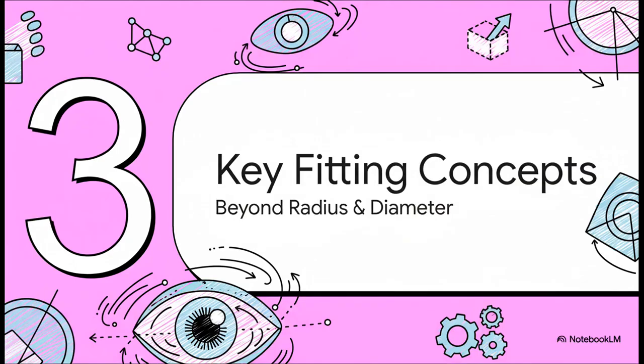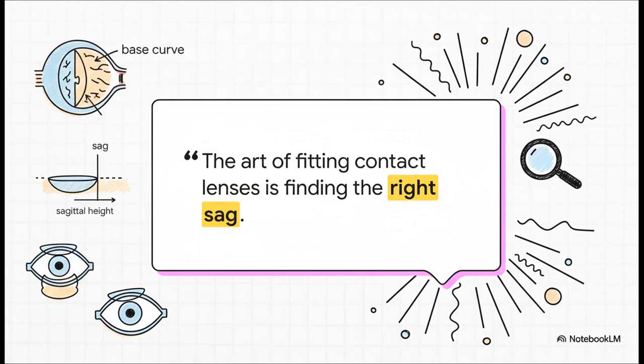And that actually leads us perfectly into Section 3, where we're going to talk about the key concepts that are really changing the game in contact lens fitting today. We're moving way beyond the old school approach. And if you want to sum up this new way of thinking in just one sentence, this is it. The art of fitting is no longer just about matching a base curve in diameter. It's about finding the correct sagittal height, or sag, for that particular eye. This measurement of the lens's depth is the true key to a perfect fit.